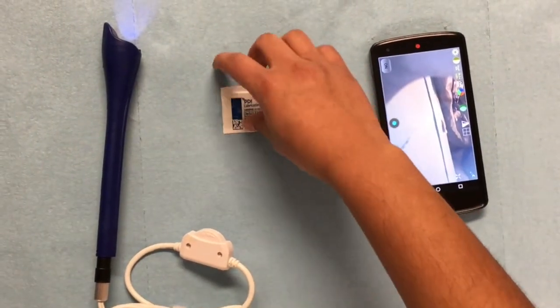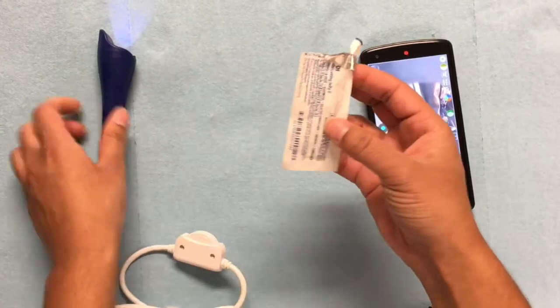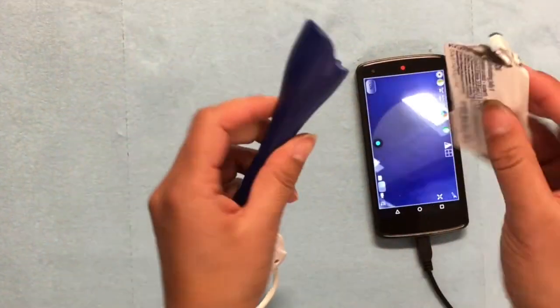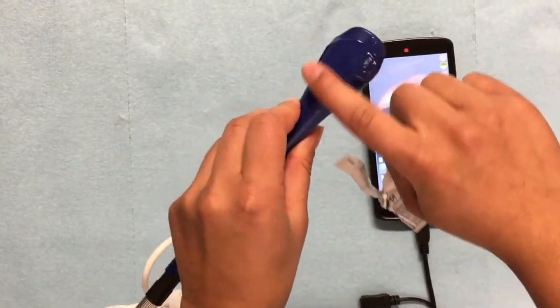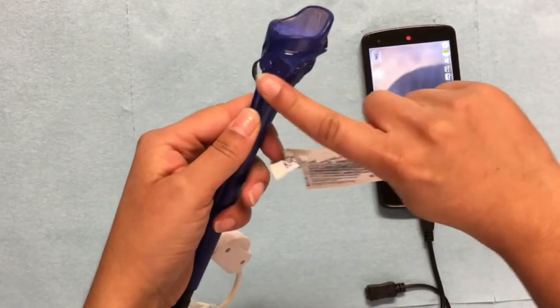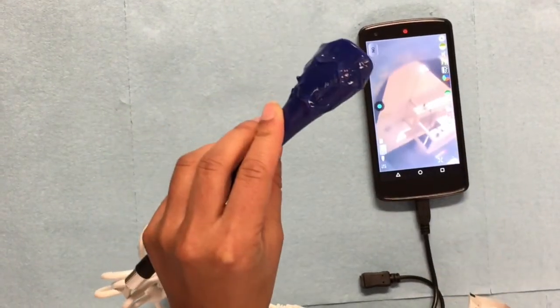Next, open the lubricating packet and smear the jelly onto the outer top of the device. Now we are ready to insert the Kala.